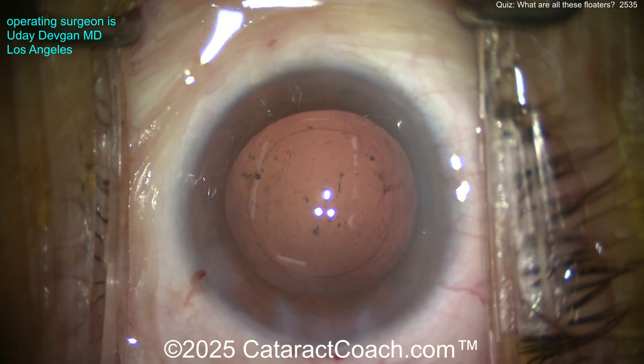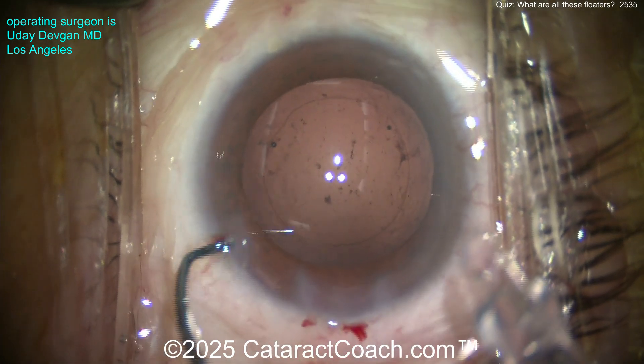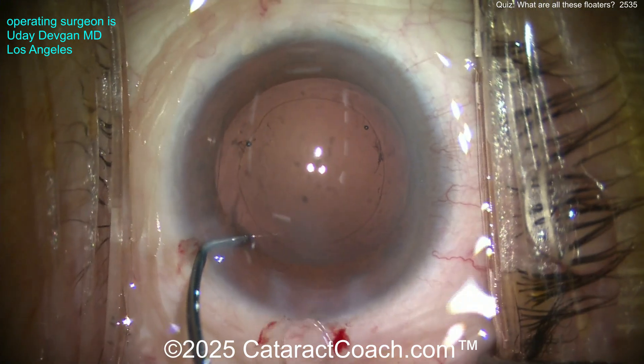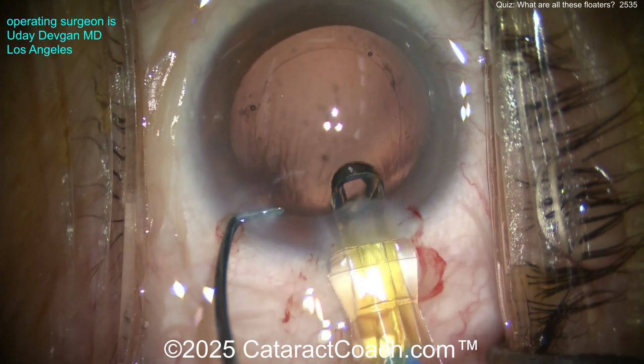I'll polish up the undersurface of the anterior capsule rim here. Especially in a case with loose zonular support, we don't want phimosis later, so let's clean that up reasonably well. Now look at all those opacities back there — that's lens material. It's going to cause some inflammation, but it's not a big deal. They don't need a vitrectomy; it's going to dissolve away in the cascade of inflammation.